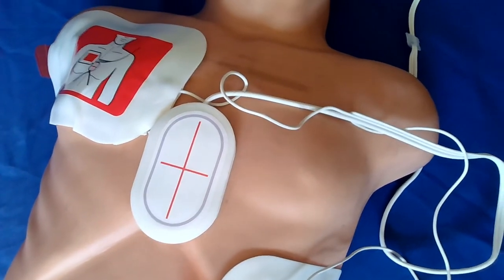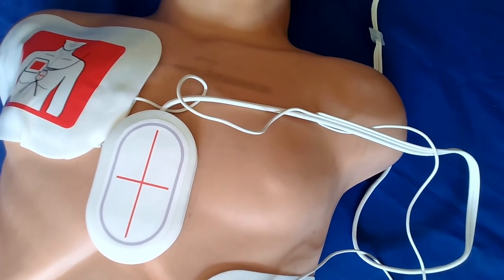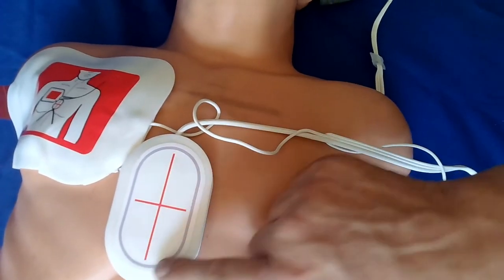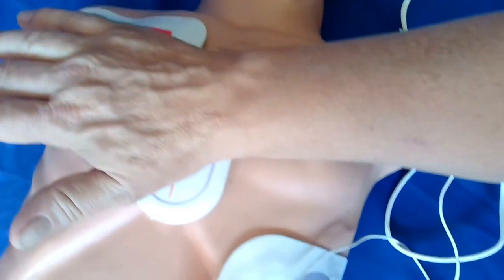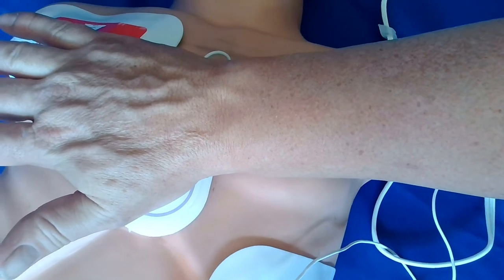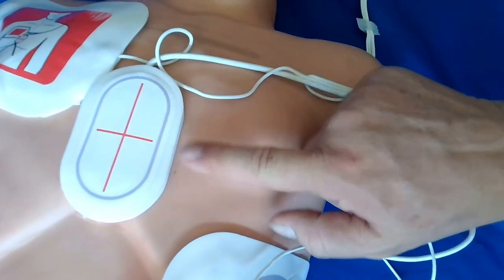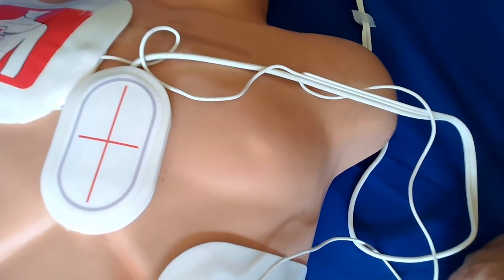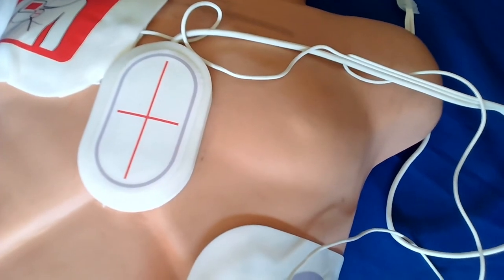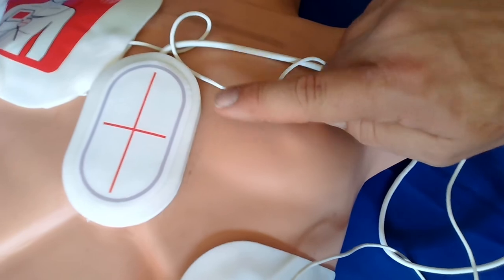When we are doing CPR, we need to make sure that our hands are positioned on the accelerometer. So we place our hand on top when we start doing compressions, because the movement of this going up and down is what sends feedback to our device. So it'll send back the depth that we're going, the rate that we're going, as well as to make sure that there's enough recoil.